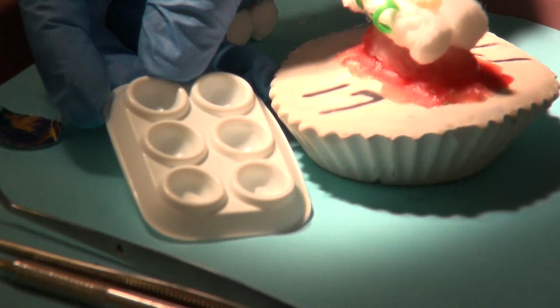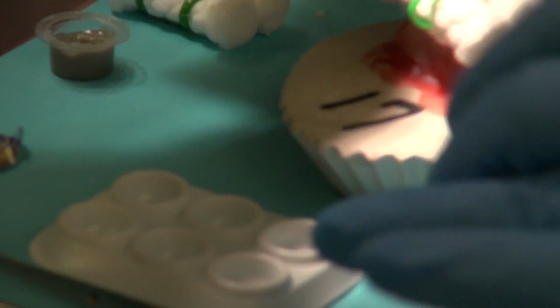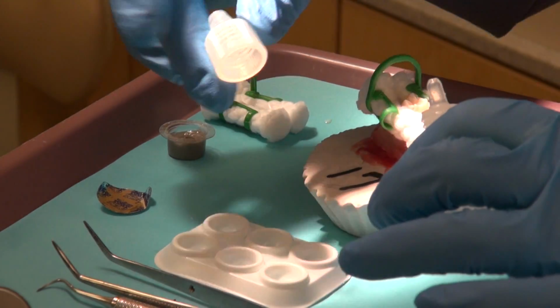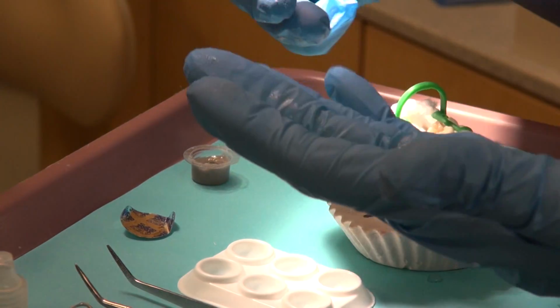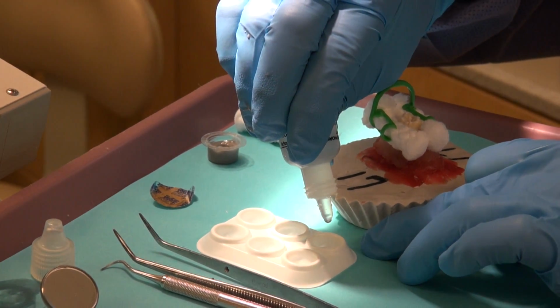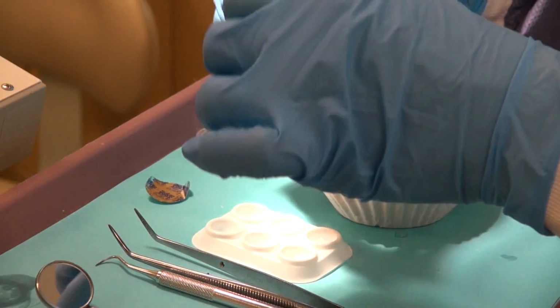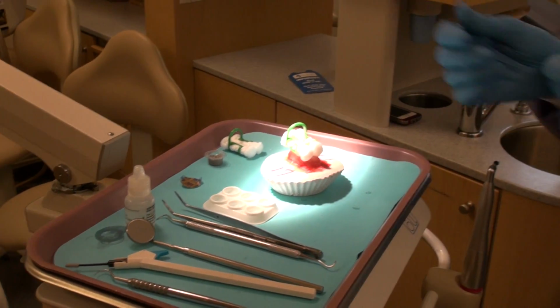If you can see in this well, I have little applicator sponges, so we can place the liquid etchant on the occlusal surface. As you can see, this liquid etchant is seeping out a little bit, and I'm getting it on my gloves. Put about 3 drops in this well. And you want to be very, very careful that if you do get it on your gloves, you either rinse it or change your gloves.